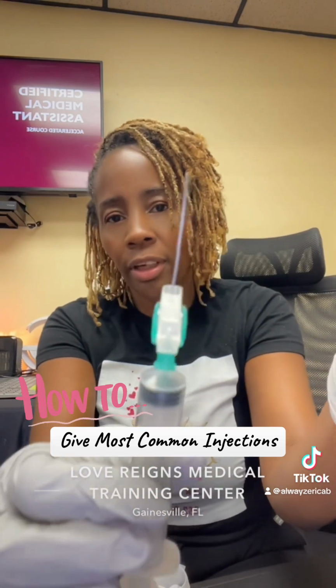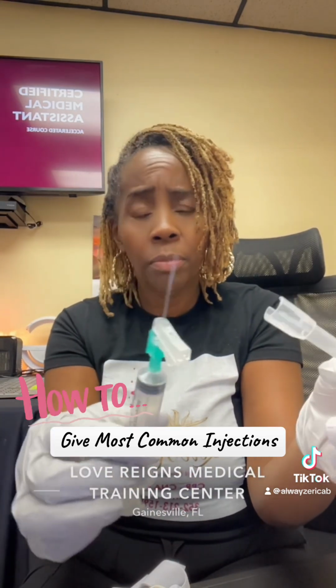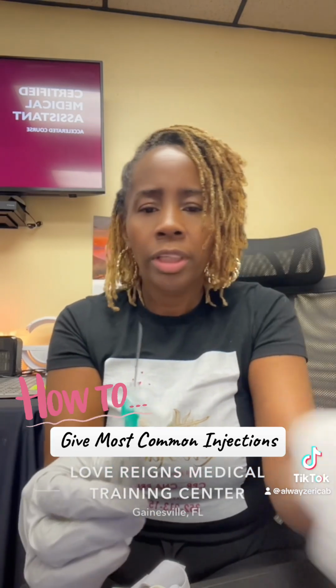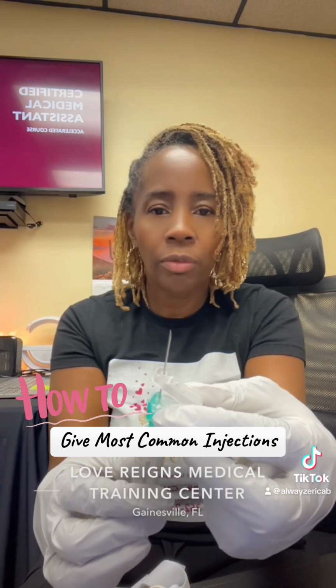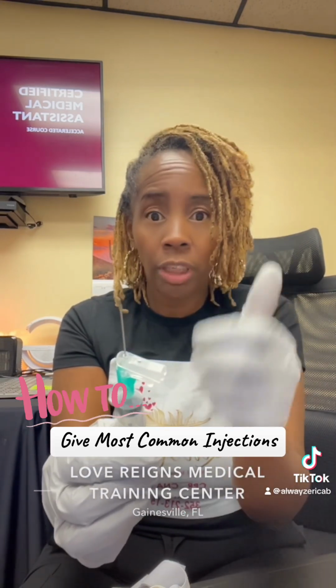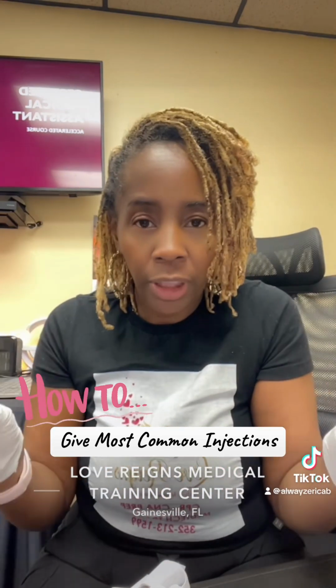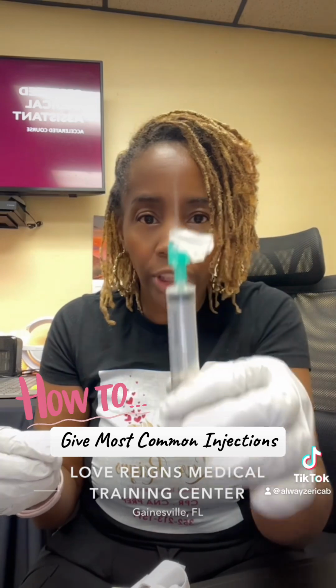And this is a big needle, y'all, 21. But we wouldn't probably be using a 21, okay? Probably more like a 25, okay? But this little piece here is what's going to lock the needle once you're done, okay? So once you're done, you're going to push that up and that'll lock the needle so you don't have an accidental needle stick, okay? That's the biggest number of injuries in healthcare, accidental needle sticks. So we've got to make sure we're always careful with that, okay?